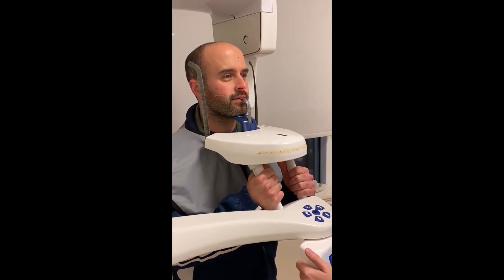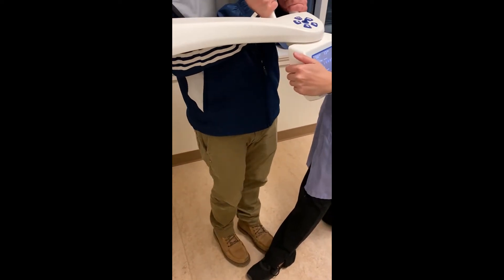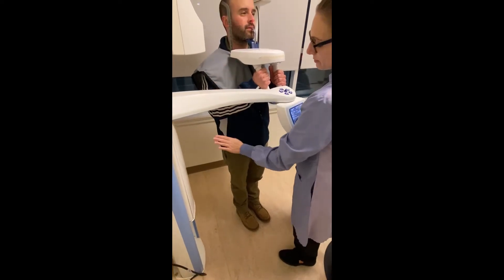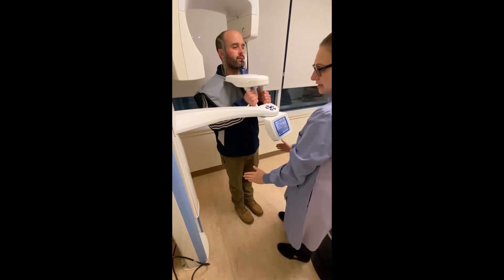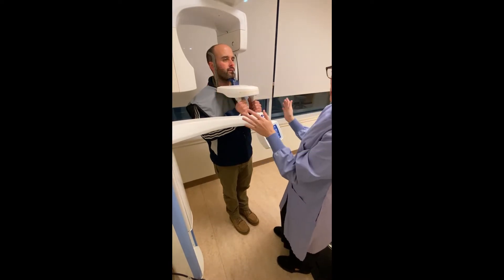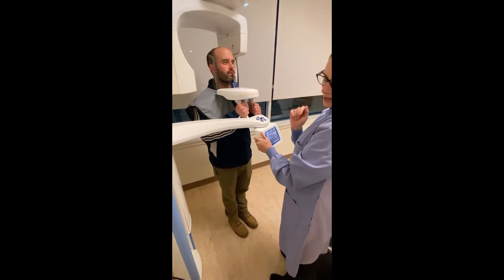Have the patient step forward a few inches. What we're looking for is the shoulders to be in line with the hips, in line with the knees, and in line with the ankles, with the body slanted forward so the head of the instrument can get all the way around the shoulders with no issues. This is the proper body positioning for the panorex X-ray.